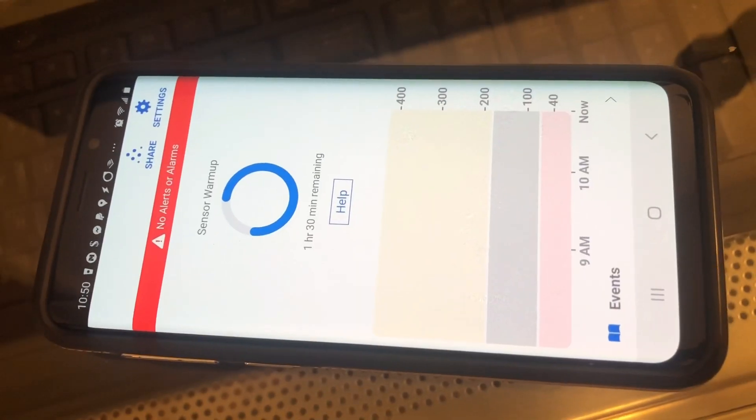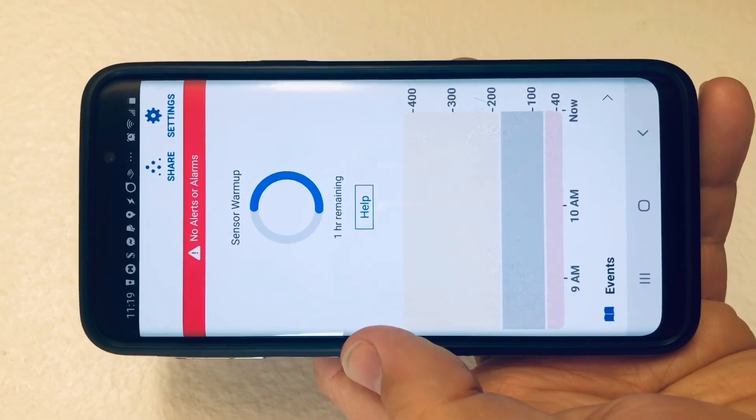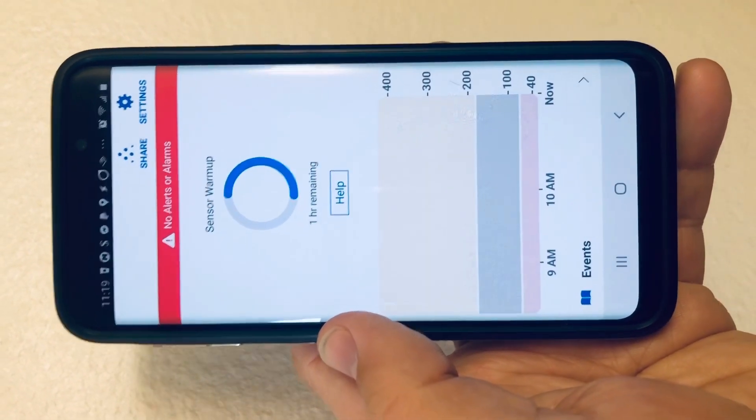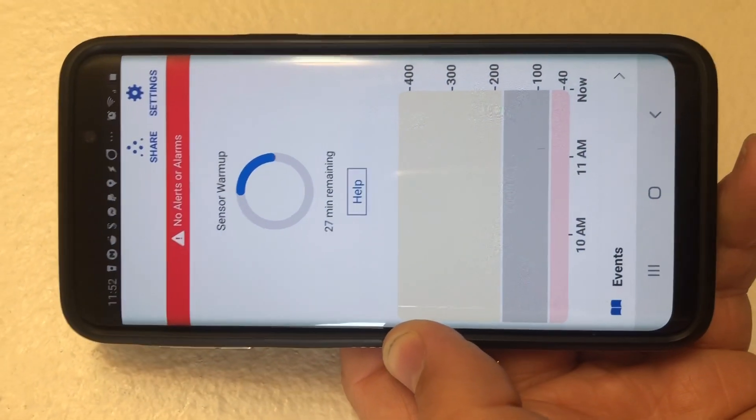As you can see, I've restarted the transmitter in the old sensor and it's performing the warm-up. Looks like I'm down to one hour remaining for the warm-up as I'm reusing a Dexcom G6 transmitter and sensor. This is a good sign — we're down to 27 minutes left and it's still warming up with no errors.